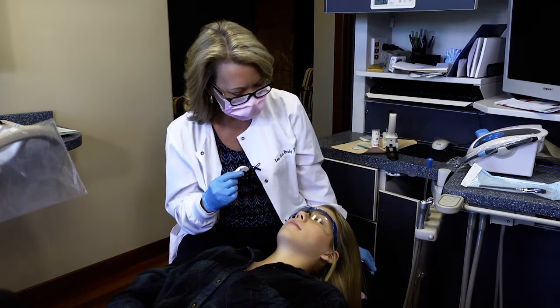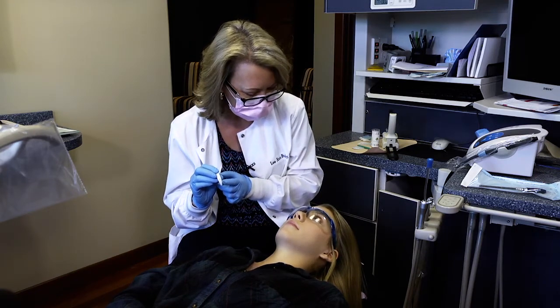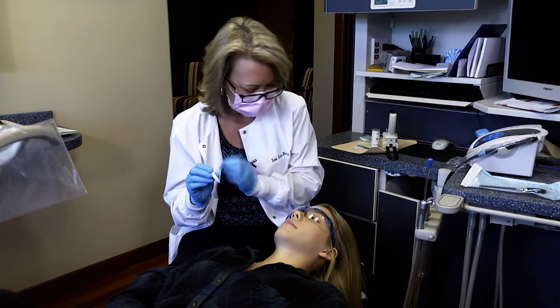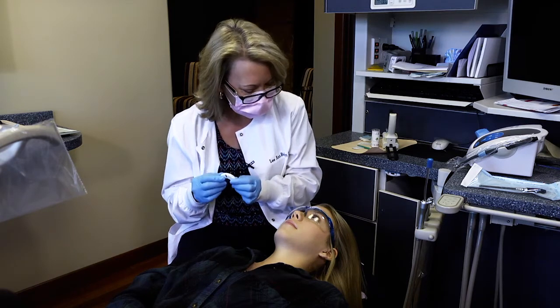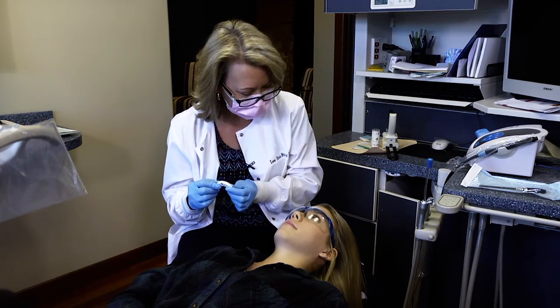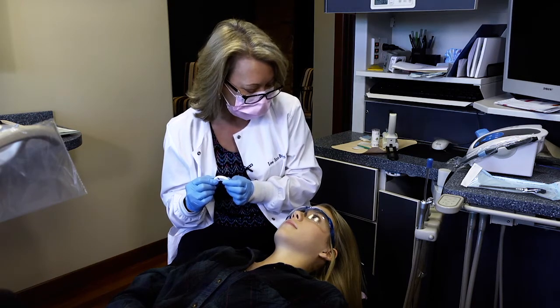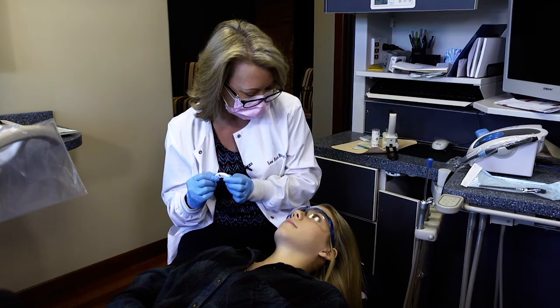Now that we've tried this in, I'm going to put a material in here that is the same stuff we use when we take impressions of your mouth to get models of your teeth. It's a little bit gooey when I first put it in, and it doesn't have a bad taste. I'm going to put this over your teeth and ask you to gently bite together, and then we're going to hold that. This material sets relatively quickly, but we'll leave it until it gets to a hard set.